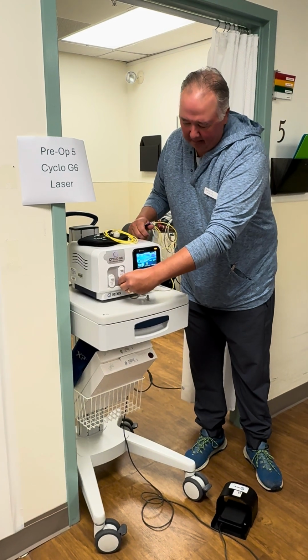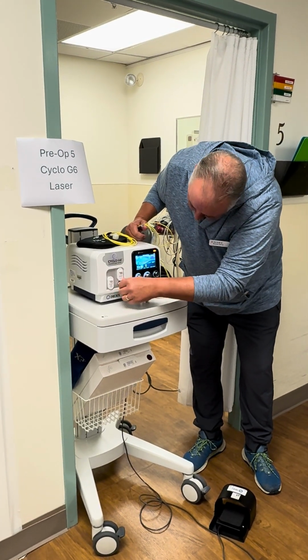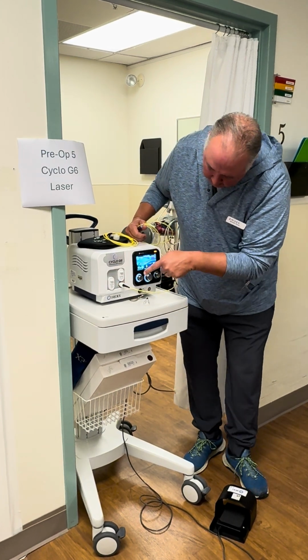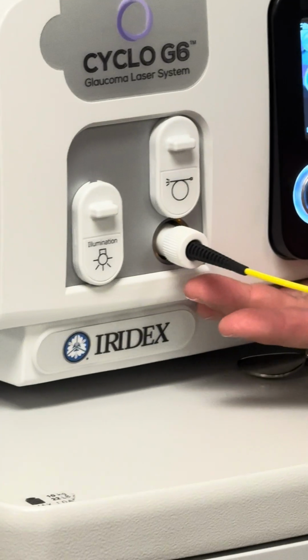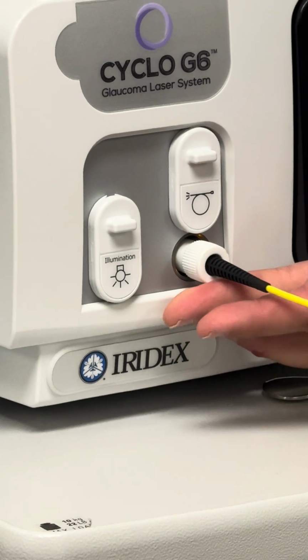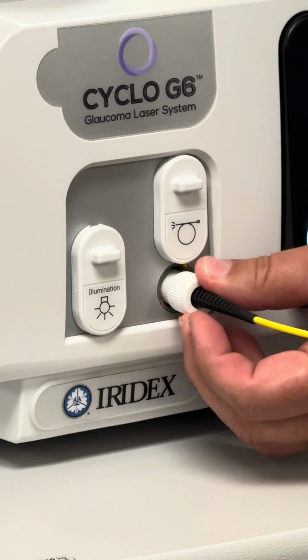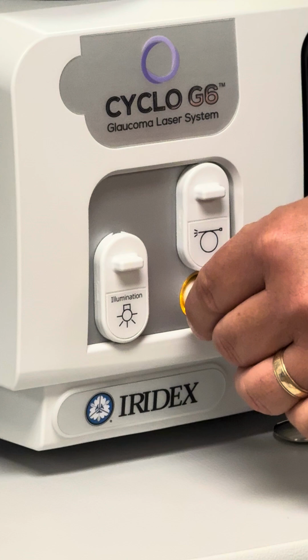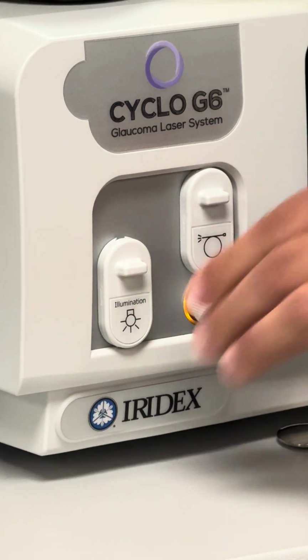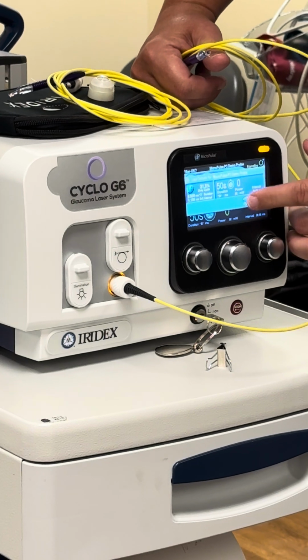Now when you do set this up, there's a little yellow ring inside, and as you tighten this up, the ring will illuminate fully, like that. So I'm going to go to settings first.